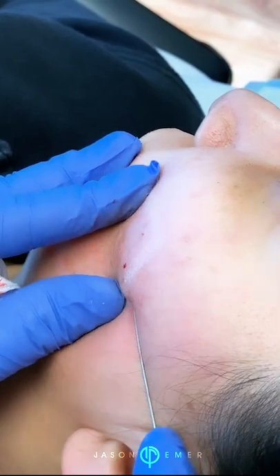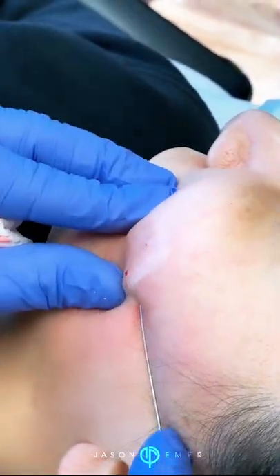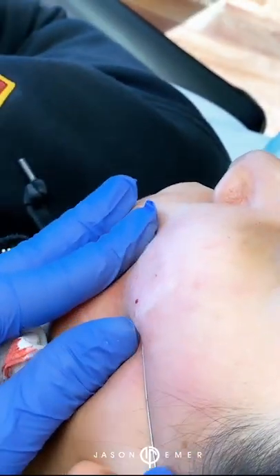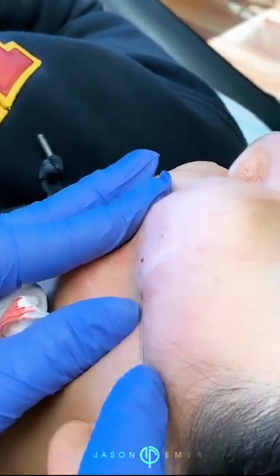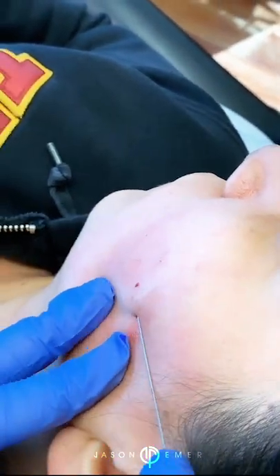Now, when you have a deep scar like this, we grab the skin and go right on top, and that's why you can see it kind of scraping. I'm scraping right here, because that's allowing me to break apart that scar.